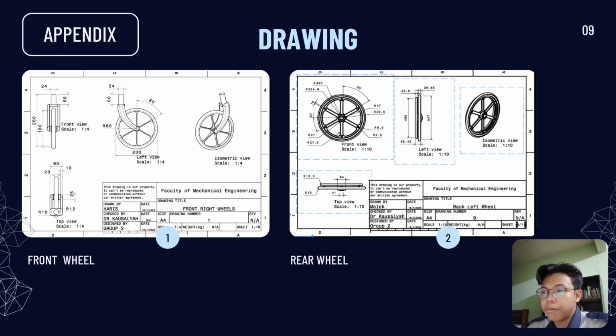So moving on to the appendix, where I'll explain more on each of our drawing parts and also the assembly plus the bill of material. So as you can see, we have the front wheel and also the rear wheel that we have made. Each of these parts is part of the assembly of our wheelchair.